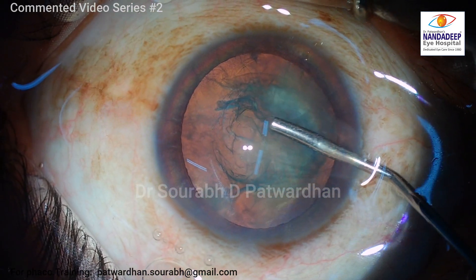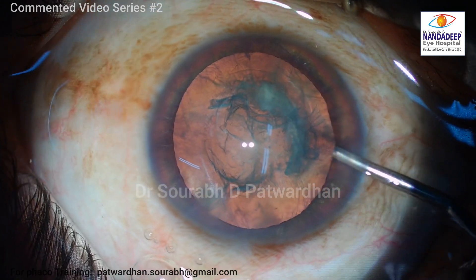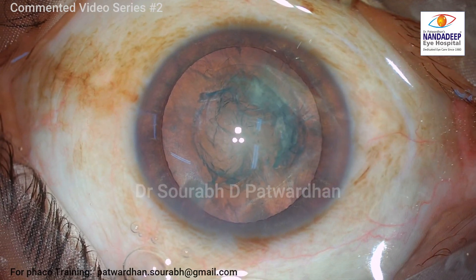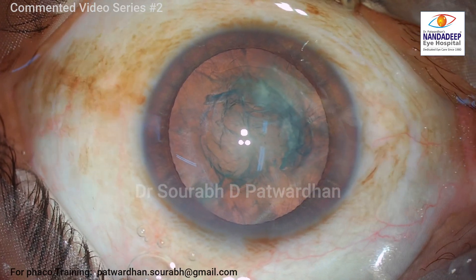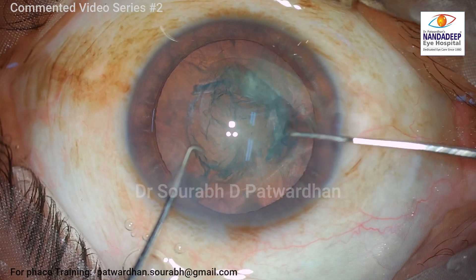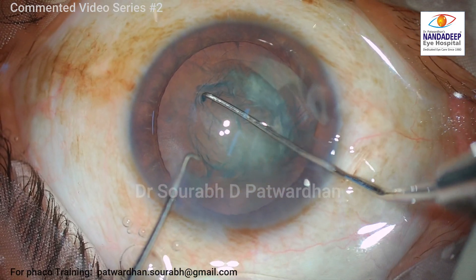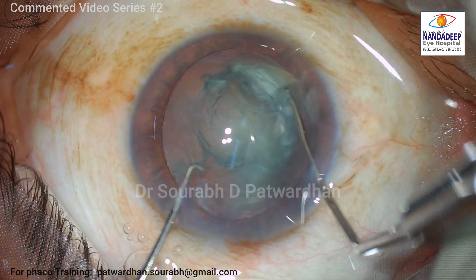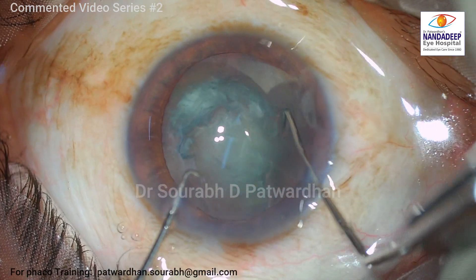The anterior chamber depth here is normal — it is not a very deep chamber. The lens thickness is also less. So I have to be careful about the position of the posterior capsule, because I expect it will be more anterior than what we expect in a case with normal lens thickness.